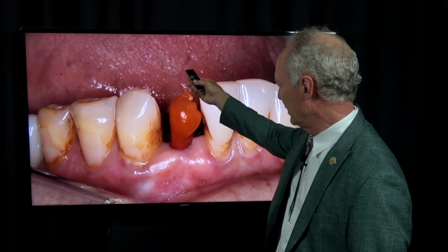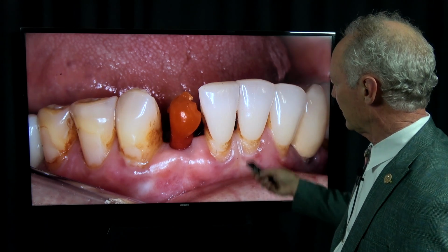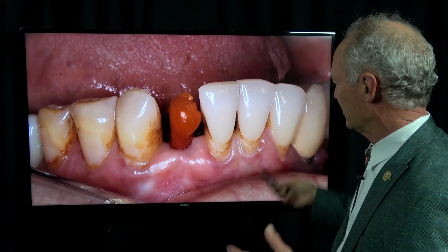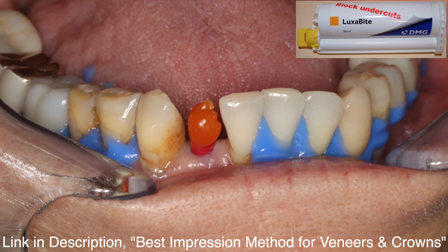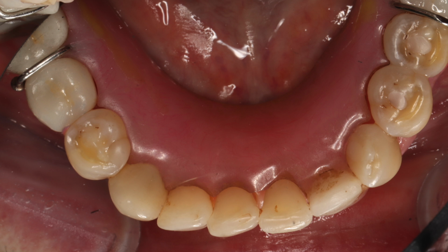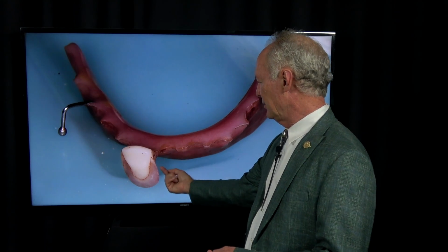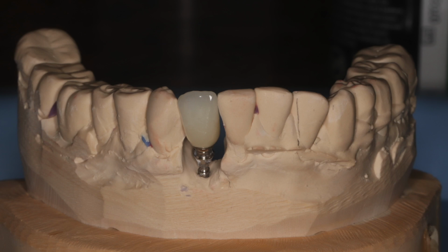Now this is the red impression coping, and this is just some wax that I've dripped on the impression coping just to make it a little bulkier so the impression grabs it better. See, this is just to give it a little more bulk. So I pulled the impression coping with a polyether with custom tray impression, putting the flipper back in place. You have to actually cut a hole in the underside or the tissue side of the flipper to accommodate the ball of the implant.